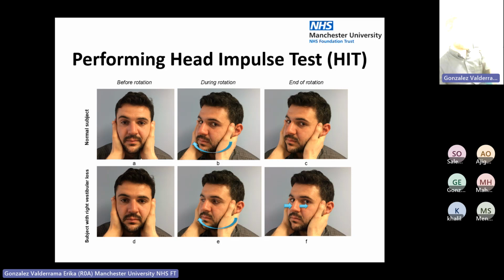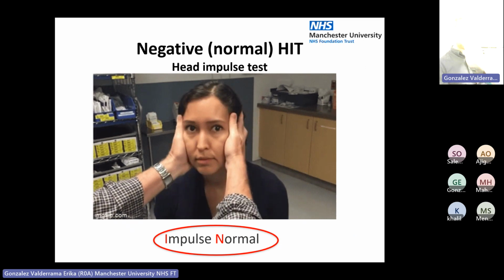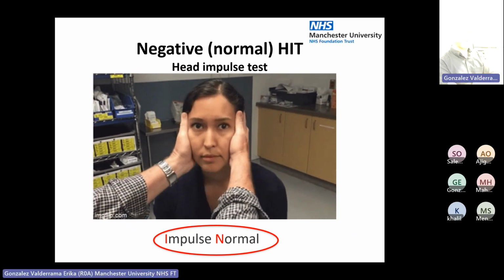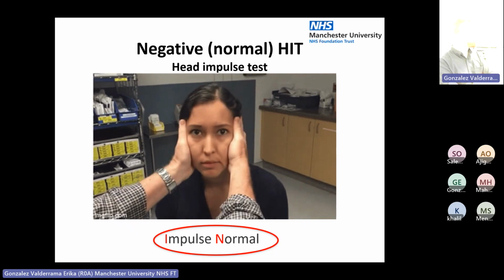So that's why you can see it with the naked eye, because it's visually driven. Whereas this movement here is not visually driven. That's why the vestibulo-ocular reflex is so important, because it happens without visual input. The eyes just get moved by the ears. So here's a normal one. What you can see is she's just constantly staring at the camera, and her eyes just seem like they're locked onto the camera, right?